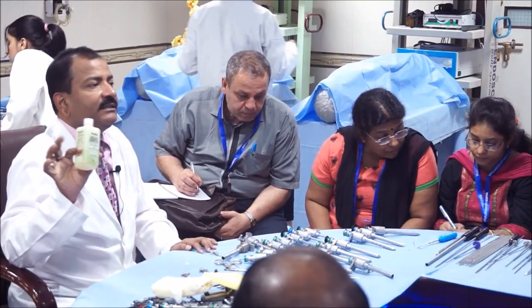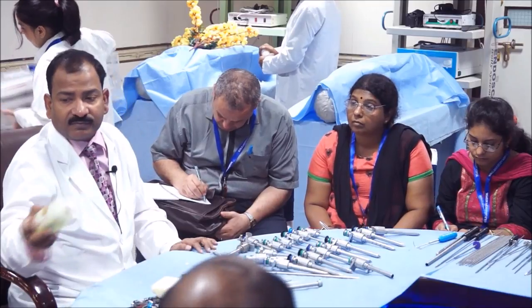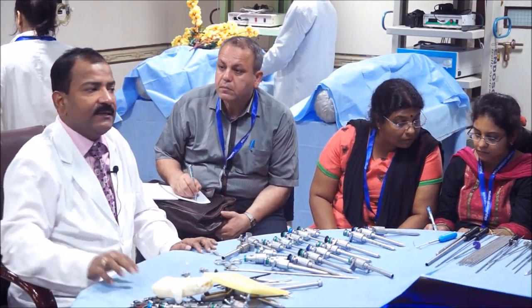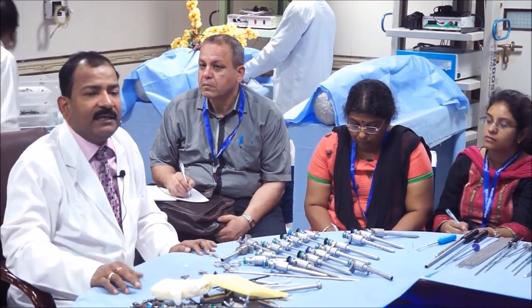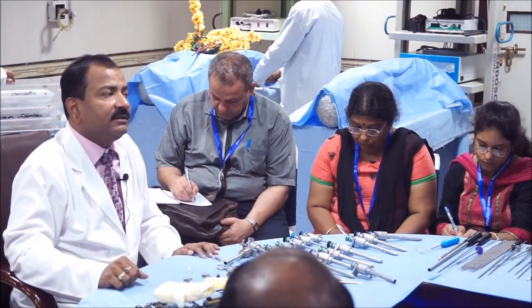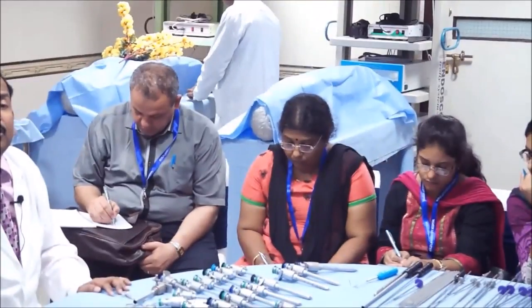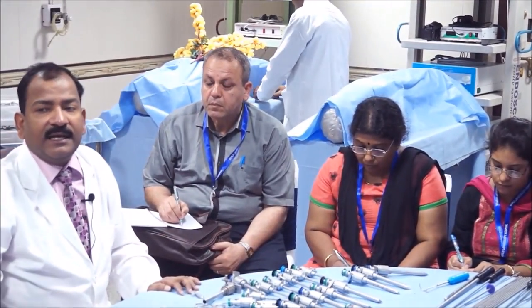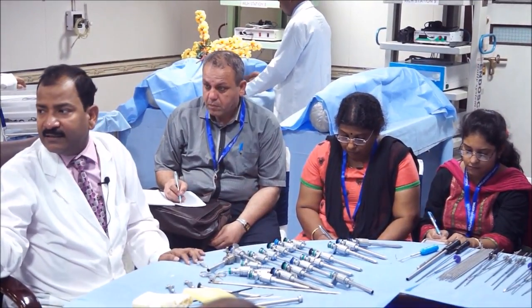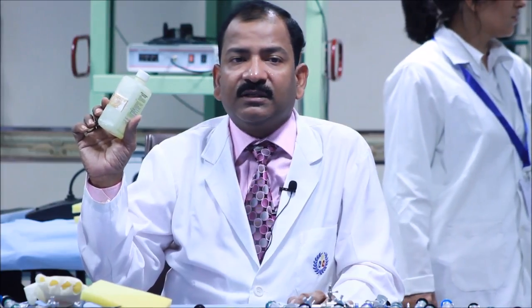So it has the advantage that within 30 minutes it is sporicidal also. Then the bactericidal time is 10 minutes. It is written here that for immunocompromised, tuberculocidal 30 minutes and HIV 30 minutes and spore also 30 minutes. So even the spore can be killed within 30 minutes with these solutions.